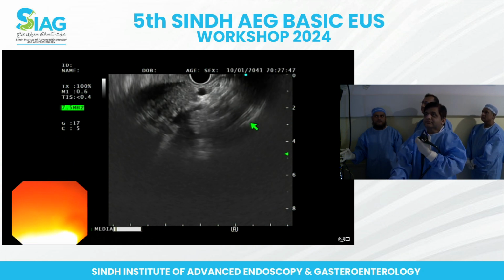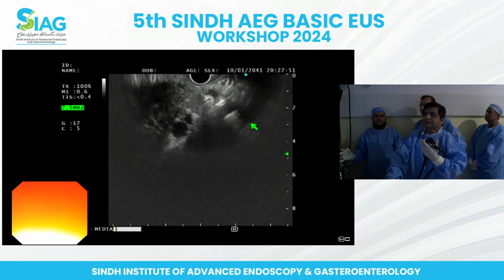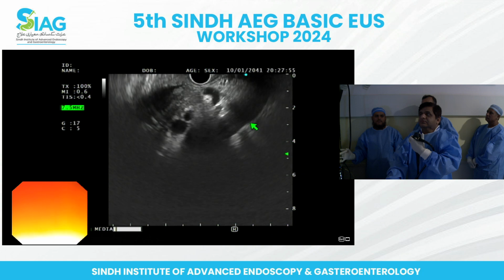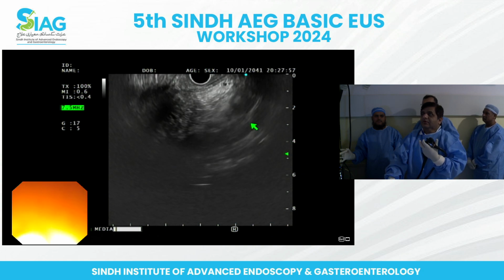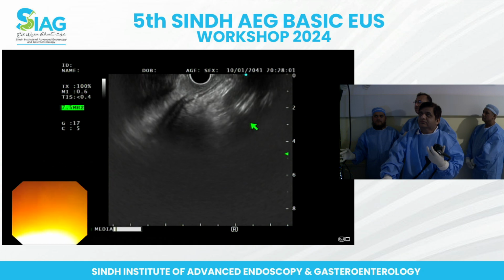He's doing better. No, he's doing very good, except one thing, that he needs to keep his finger away from the air and water button. Yes, we just saw him moving his finger away. Subtle movement, just a subtle movement.